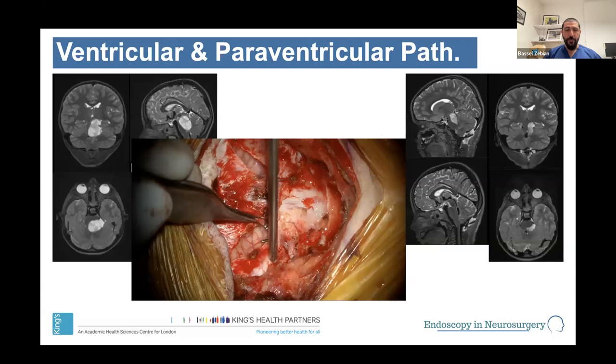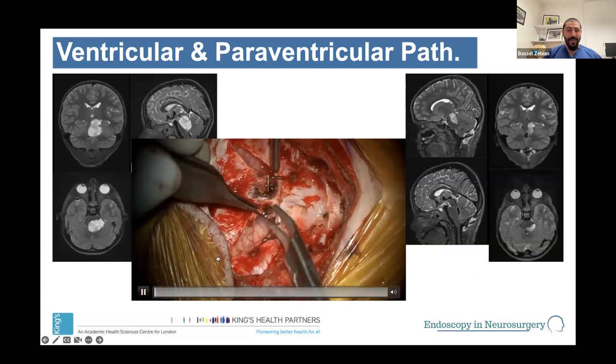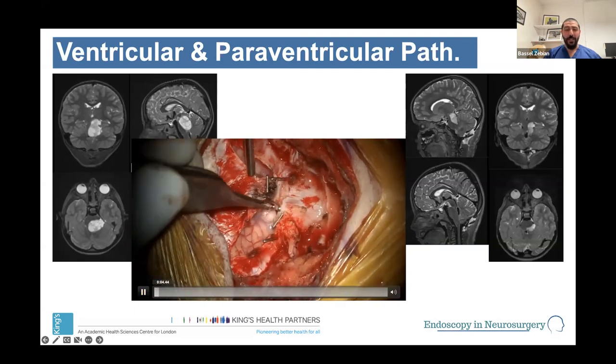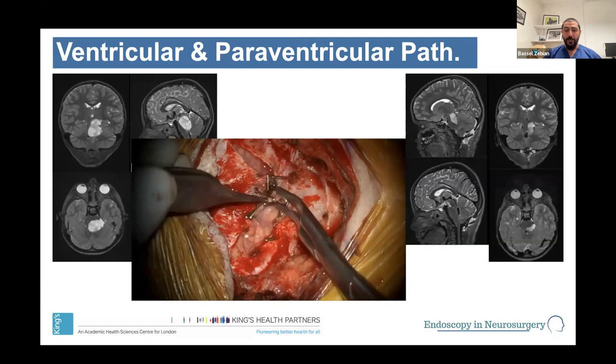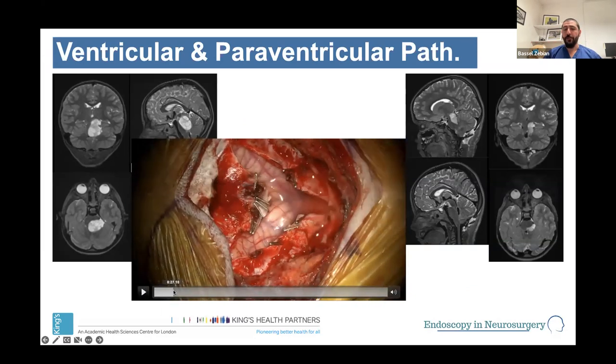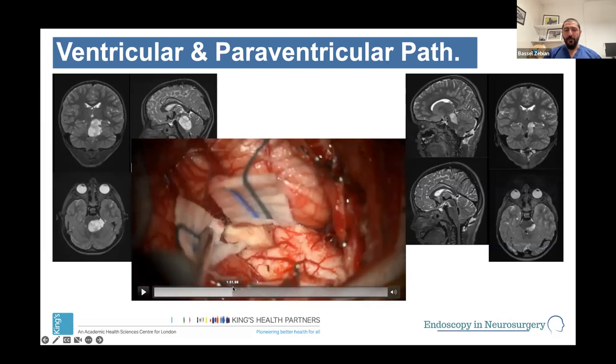And we're not going to talk about hemorrhage and infection, exactly as Professor Schroeder had done earlier, but rather than at the end, I did it at the beginning. I still use, obviously, microscopic techniques for ventricular tumors, but mainly the fourth ventricular tumors. And I'll just scroll very quickly through that because it's exactly the same as everyone else does it.